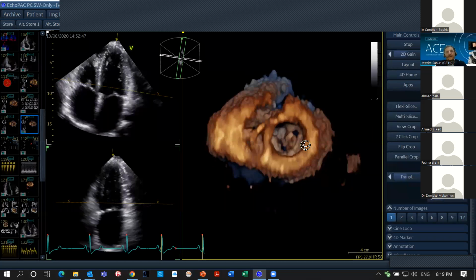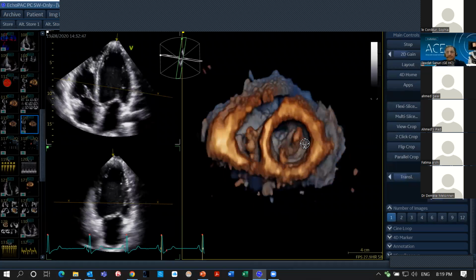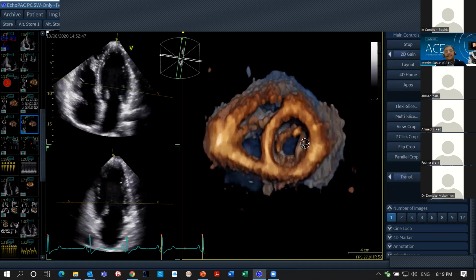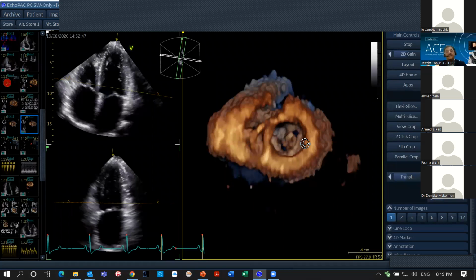And I think one of the most important outcomes of this is not only DICOM, because DICOM has been standardized for a long time, but now you have the ability to crop and navigate 4D data sets.